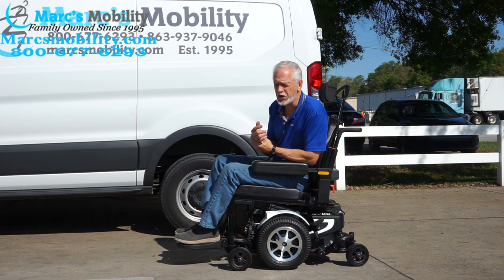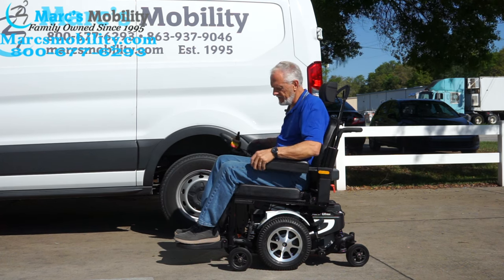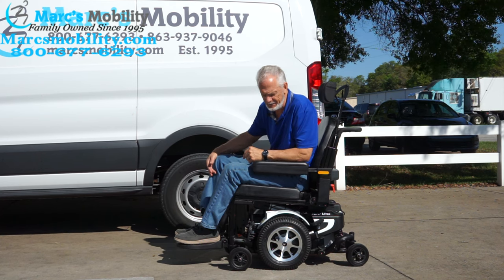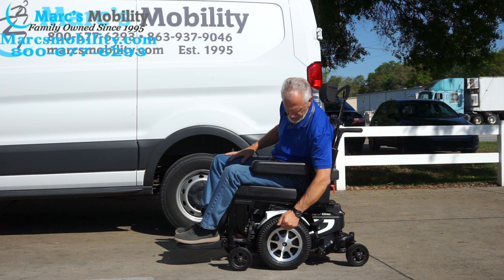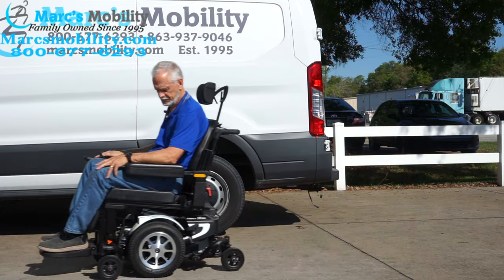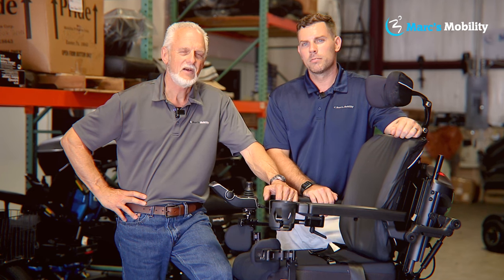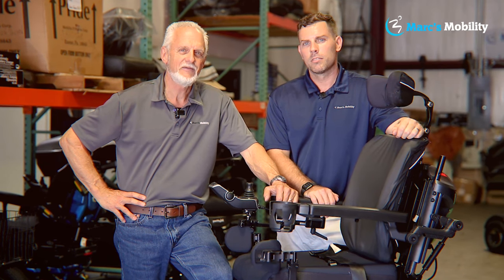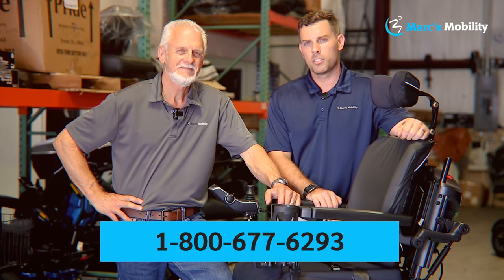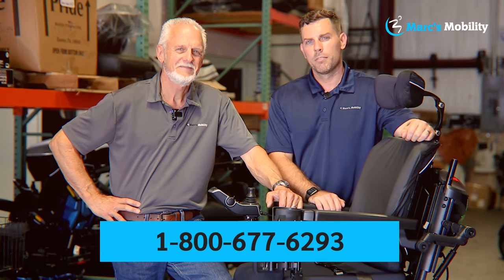This is the Merit's Vision Ultra power chair. It has the electric tilt and electric feet, flip-up arms, a 20 by 20 seat with adjustable depth, anchor points all the way around the chair, and solid tires. It has one mile on it — pretty much new. Hi, I'm Mark and my name is Alex — we're co-owners of Mark's Mobility. I started this company in 1995. We sell many products, not just what you see in this video. If you have any questions or concerns, please call us at 800-677-6293. Thank you and have a wonderful day.